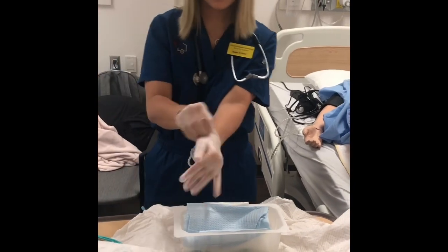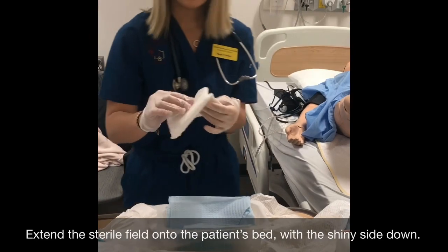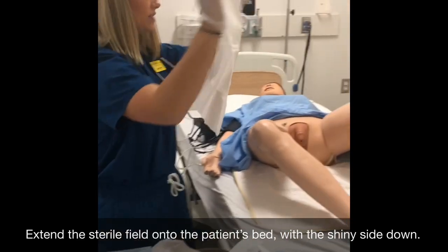Okay, so now with my sterile gloves on, I'm going to grab this sheet and I'm going to extend my sterile field. So I'm going to put the shiny side down underneath the patient.